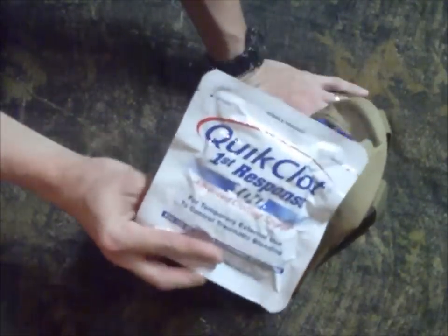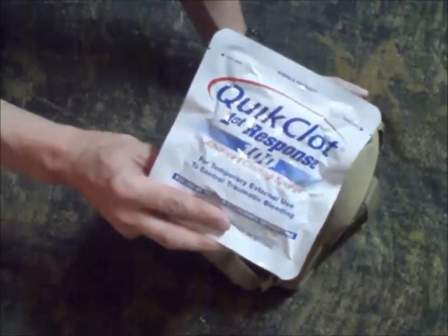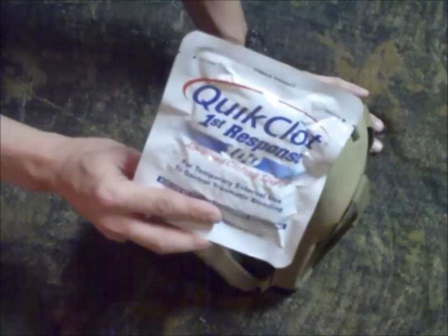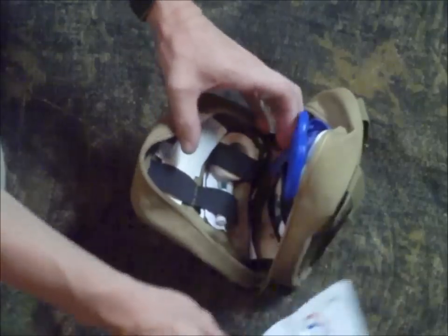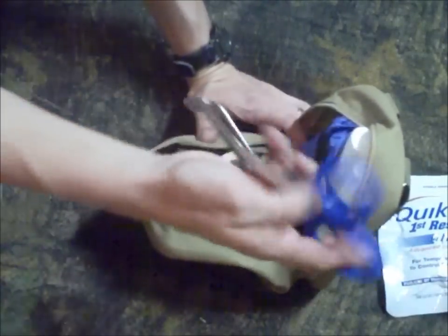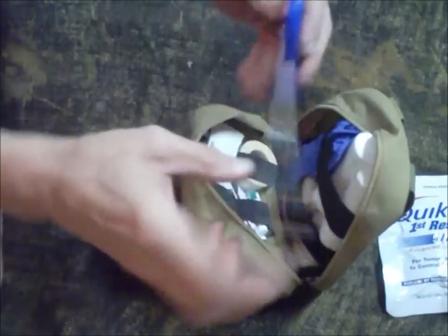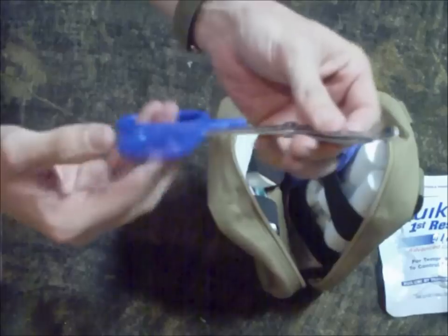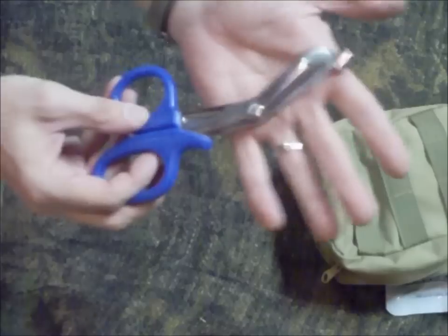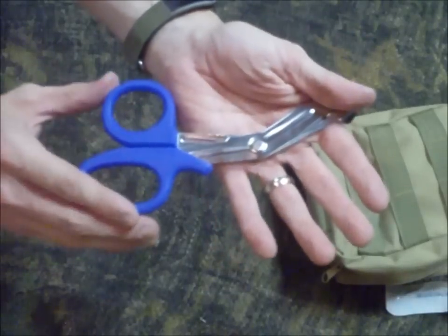First thing we're going to go through is QuikClot, and this is for emergencies only — for life-threatening bleeding that I can't get control of any other way. I also have a nice pair of EMS scissors. These are able to cut clothing and they're also able to cut pennies in half, which is a really cool trick. You never know when you might need a good pair of scissors if you don't have your pocket knife handy, so I always keep a pair of scissors with me.